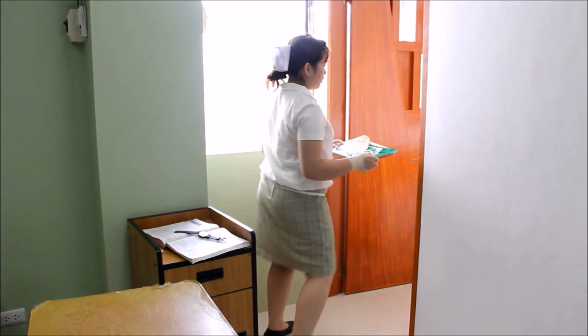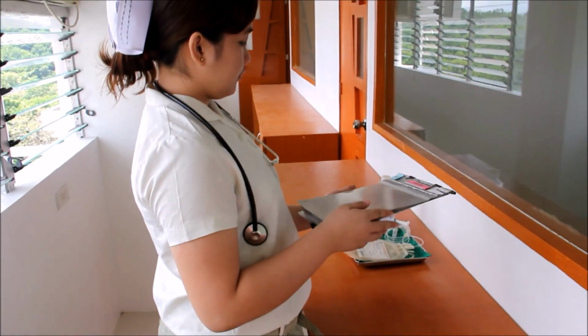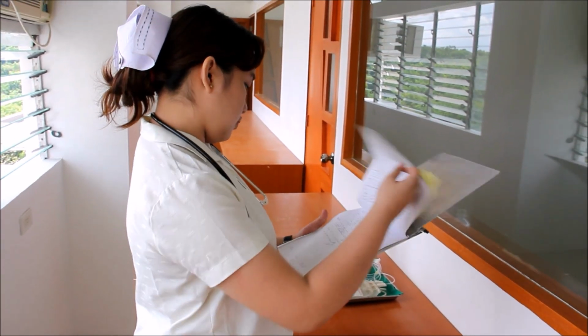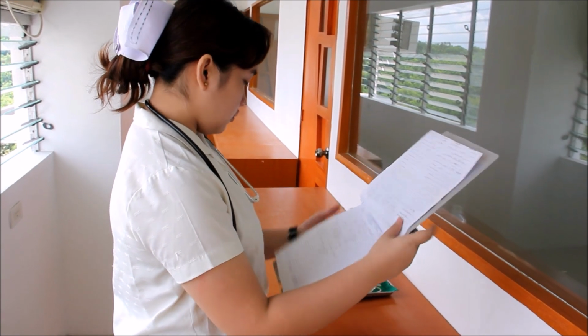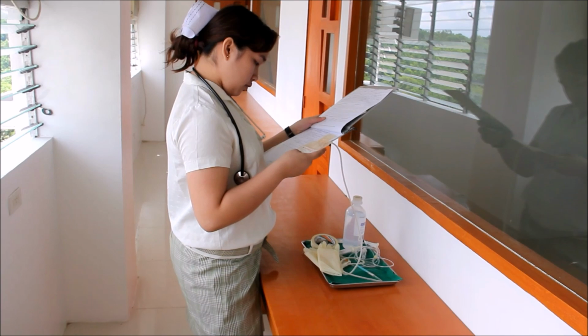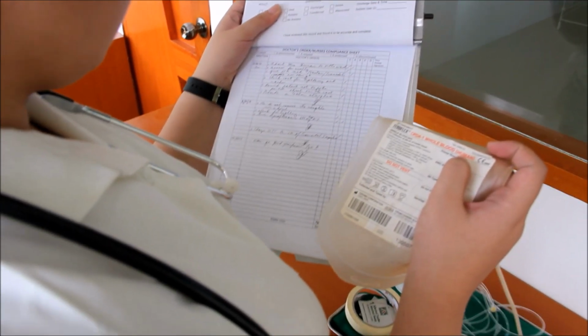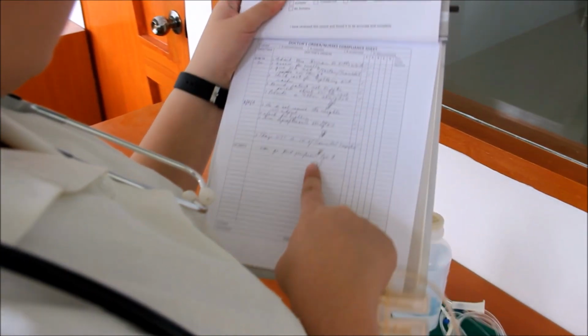On the requisition attached to the blood unit, fill in the time the transfusion was completed and the amount transfused. Attach one copy of the requisition to the client's record and another to the empty blood bag. Return the blood bag and requisition to the blood bank.